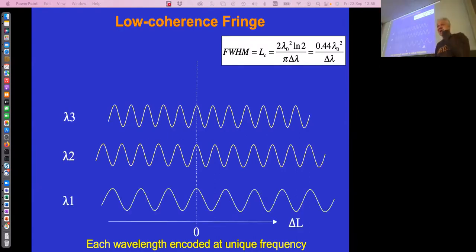And then this one. I'm looking at this half of the audience. Which one is the longest wavelength of these three? And why? Sorry? Number one is the longest. Yes, absolutely, because you need to move the mirror even further. This is the mirror displacement to get to a maximum.